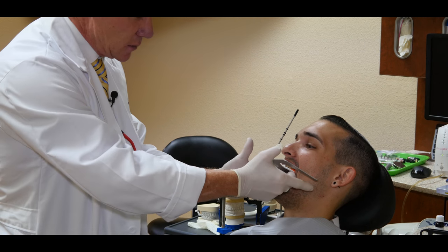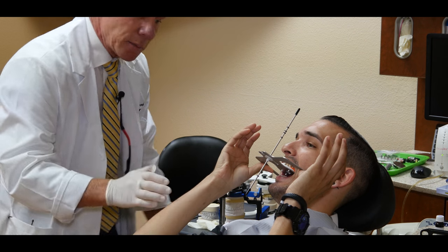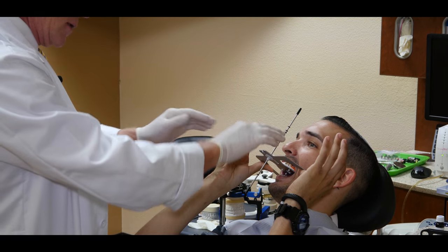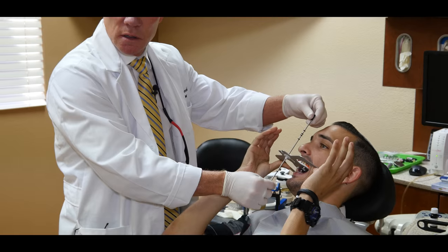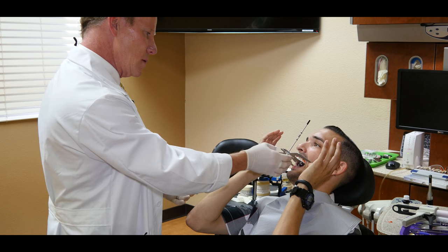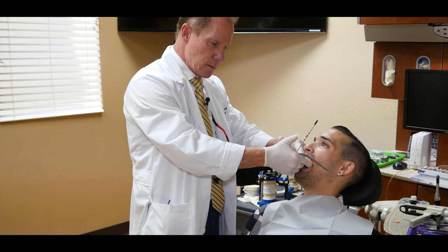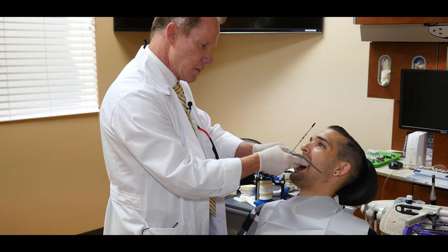Jake, I want you to take your thumbs and just push it against the bottom of that. Just like that. I'm going to look at the profile to make sure it's parallel. Perfect. I'm going to make sure that the front part of the bow is parallel to the eyes, the vertical bar is perpendicular to the long axis of the face and also at his midline. Good. Okay, you can go ahead and let go of this. Okay, let's go ahead and snap it out.